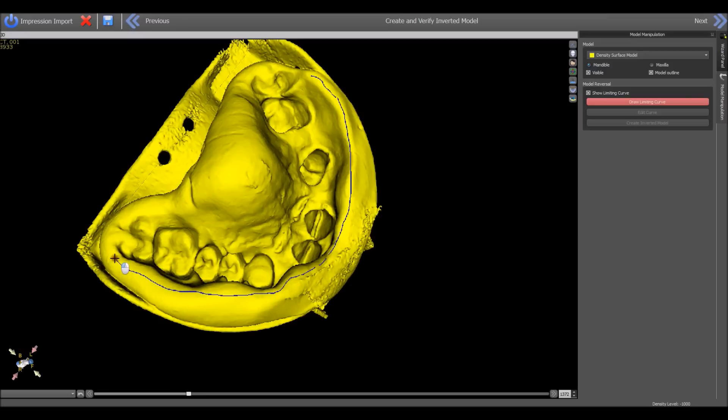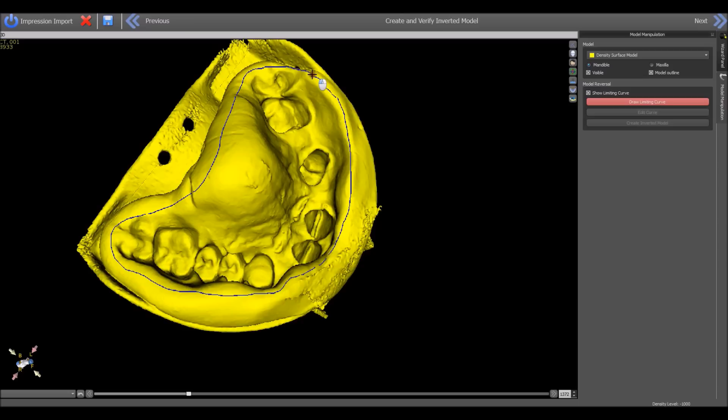Then you let go of the SHIFT key, use your left mouse button, and then hold down the SHIFT key once again when you would like to resume drawing the curve. Go back to the starting position and press edit curve.